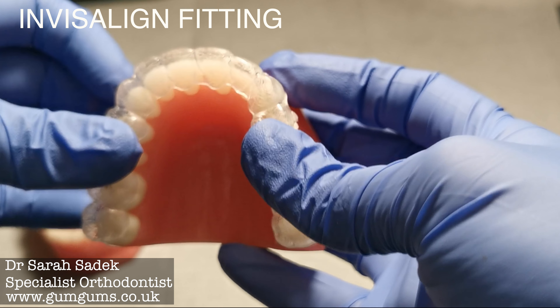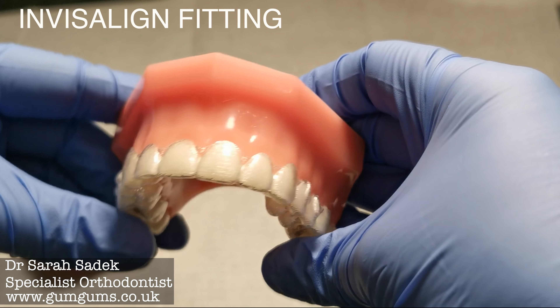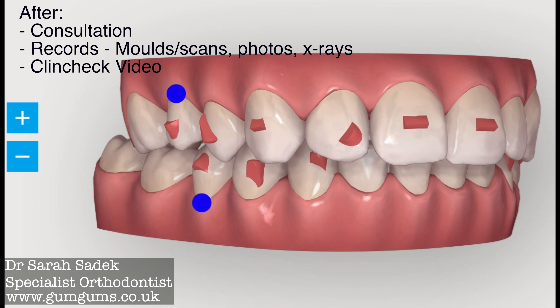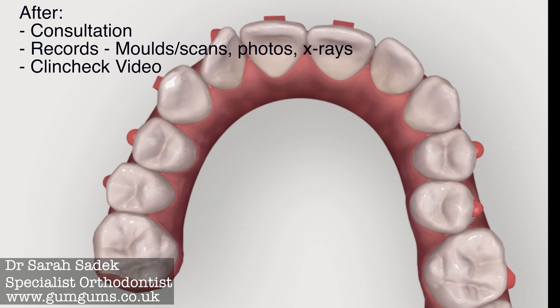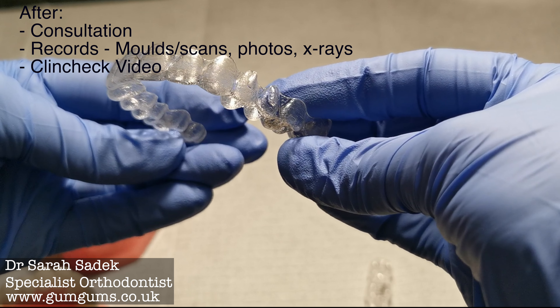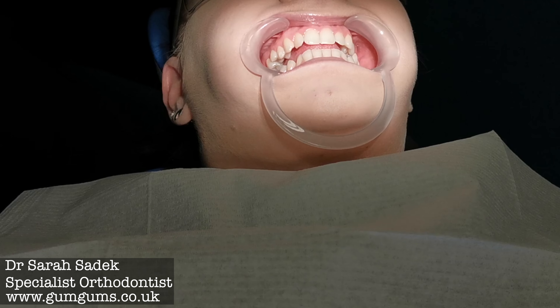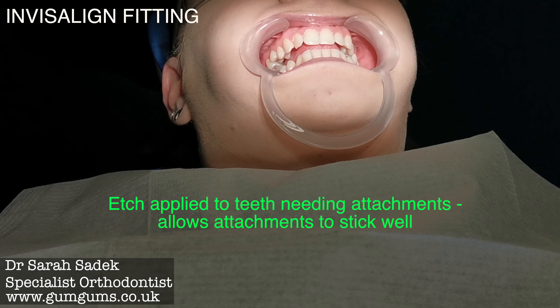Today's video is all about what happens when you go to get your Invisalign fitted. This will be after you've had your initial consultation, scans or moulds of your teeth, x-rays and photos. You will have seen a movie of how your teeth move during the process, called your ClinCheck video, and you're back in the chair ready to have your attachments and first aligner fitted.